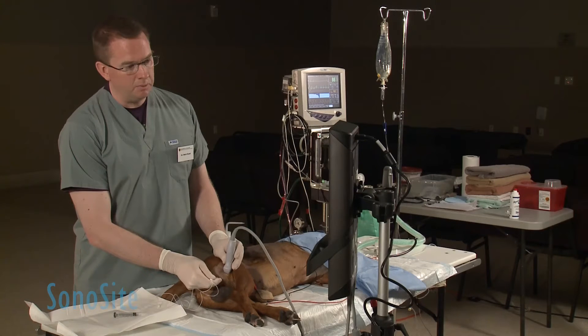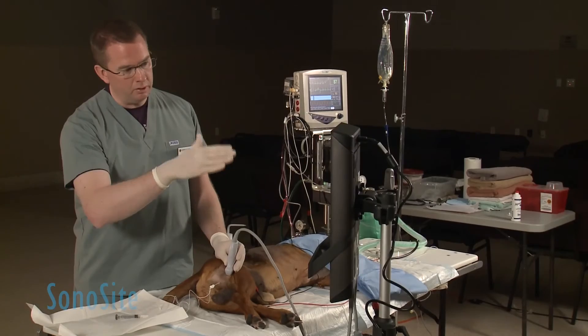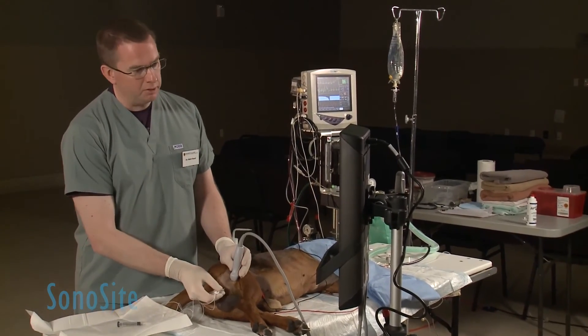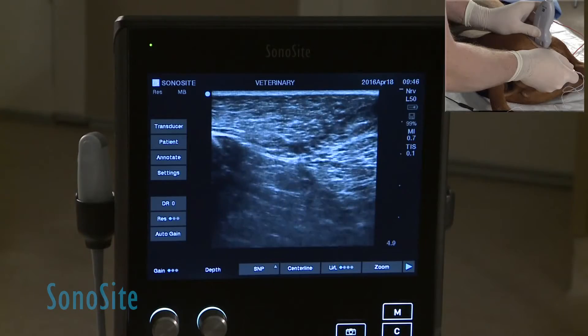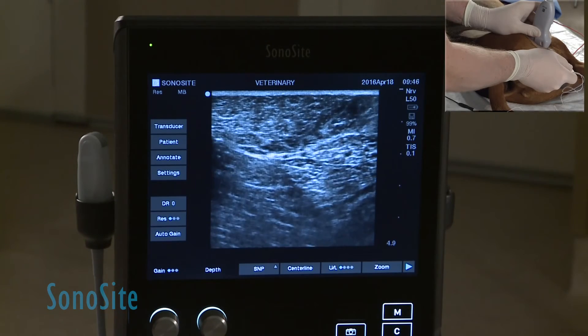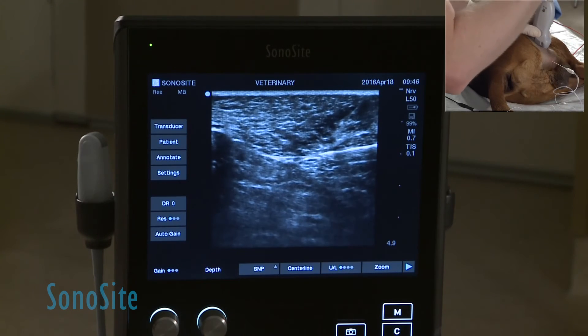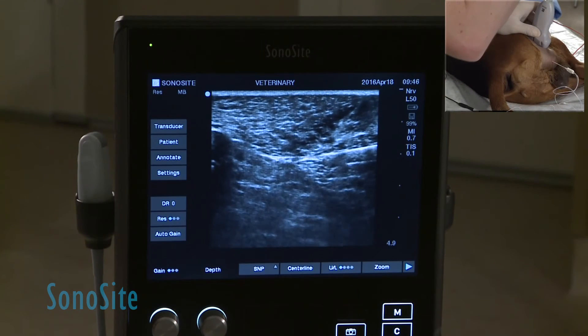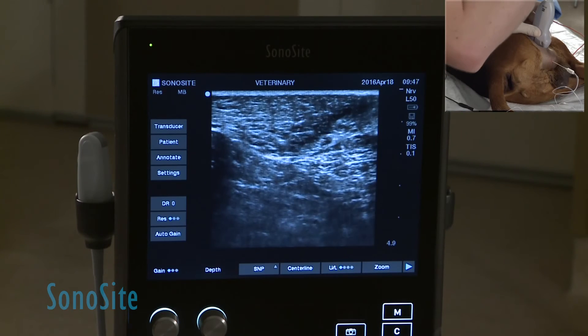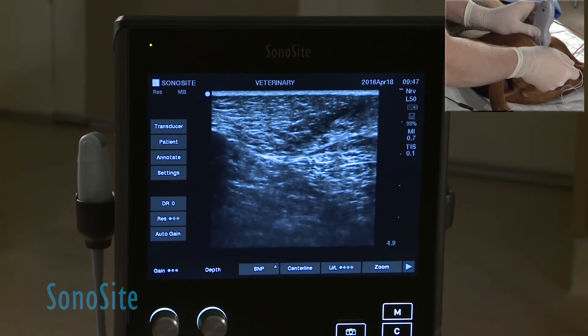Typically we try to inject some of the local anesthetic deep to the sciatic nerve first — below the nerve on the ultrasound image. We inject just a fraction of the patient's dose initially at that area, and you'll typically see the local anesthetic spreading as a hypo- or anechoic black volume.